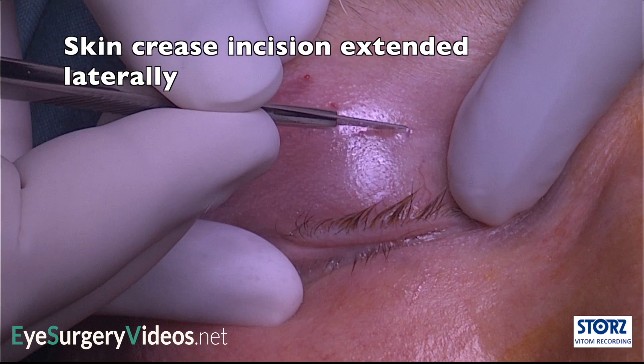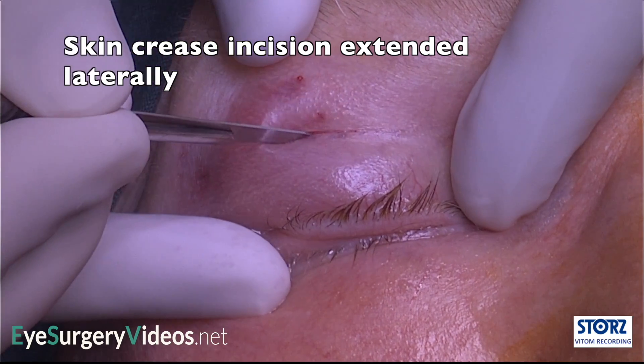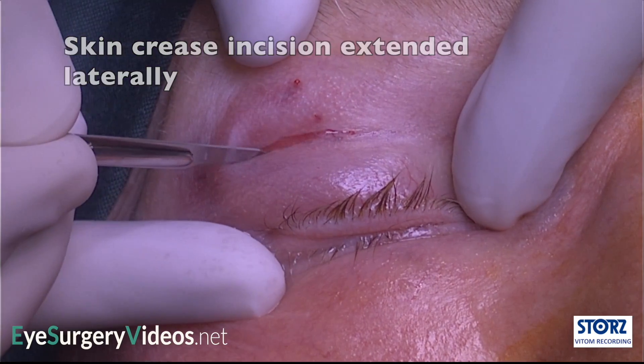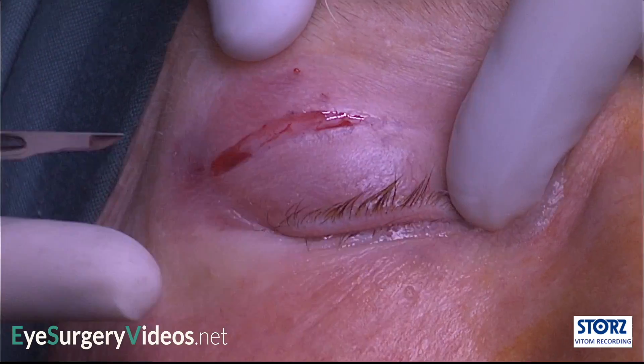The upper eyelid crease incision is very useful in accessing the superior, anterior and deeper orbital spaces. It can be extended both laterally, as shown here, or medially towards the canthus.